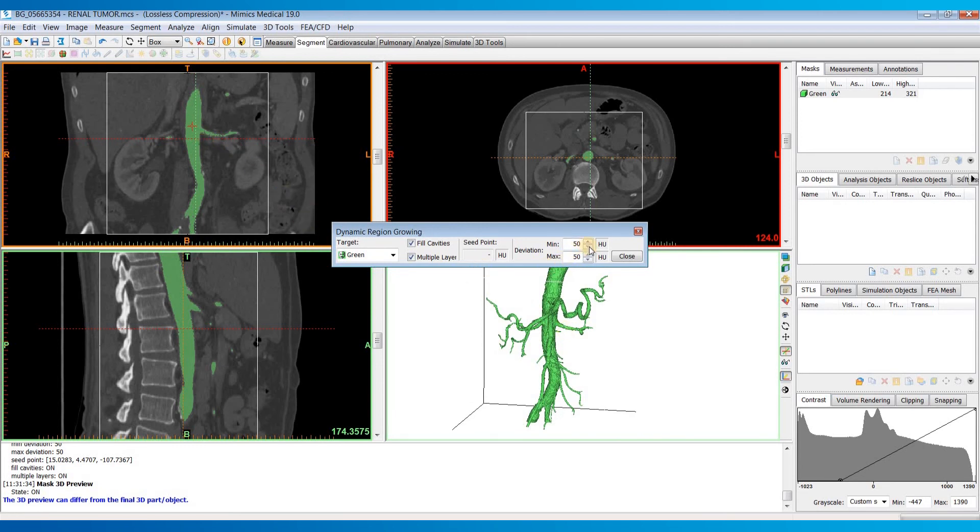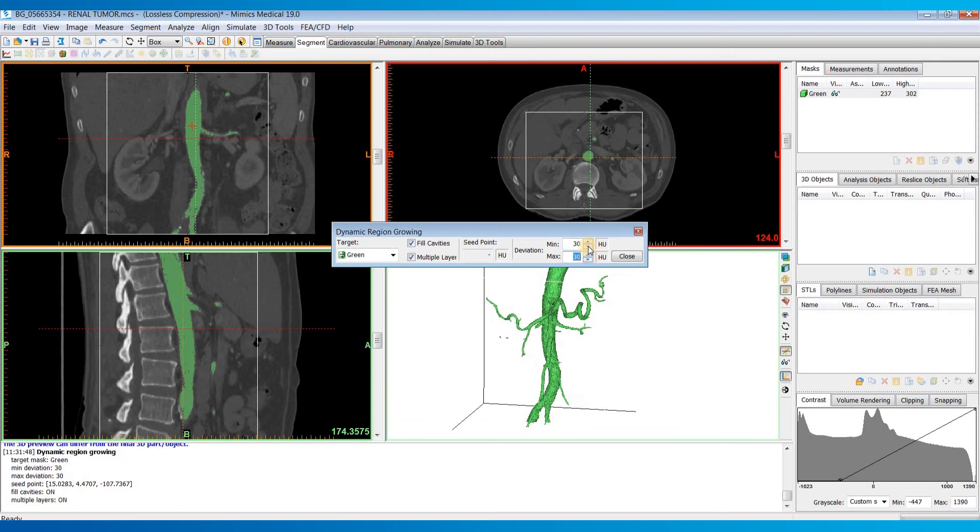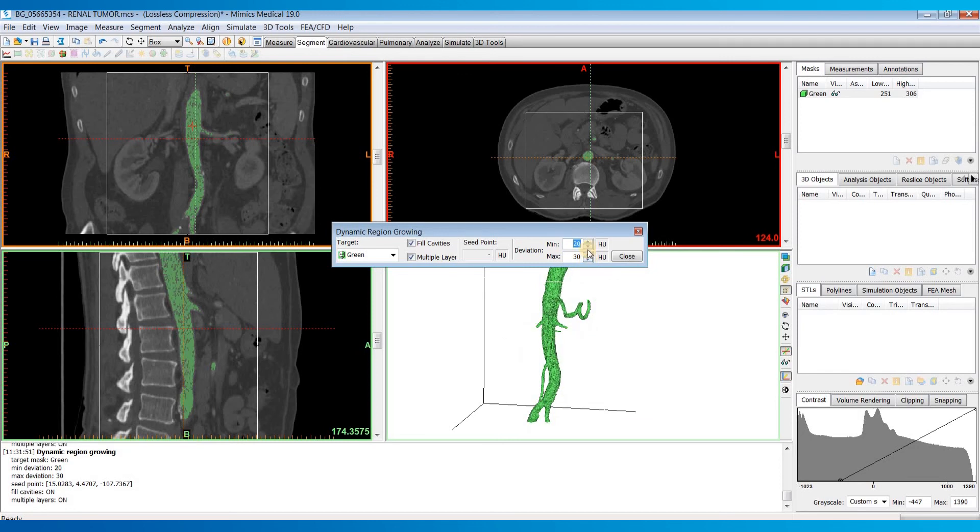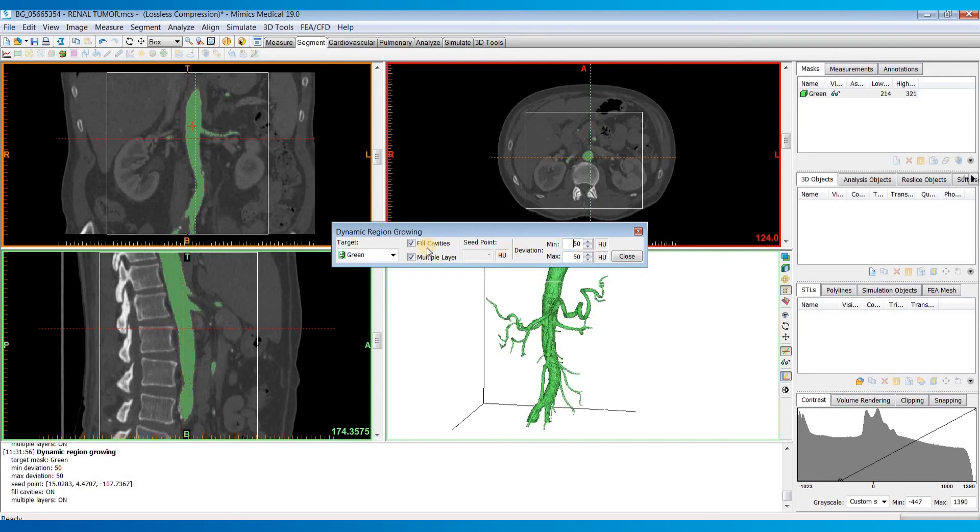You can change this deviation either before or after the effect. So you can see as I decrease this down, it's going to maybe not grow out quite as far. But I think maybe 50 for the min and max looked a little better.